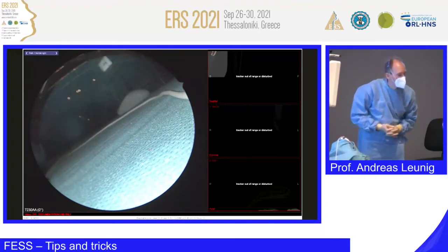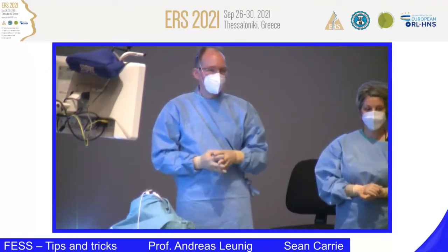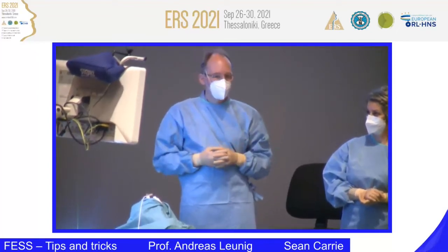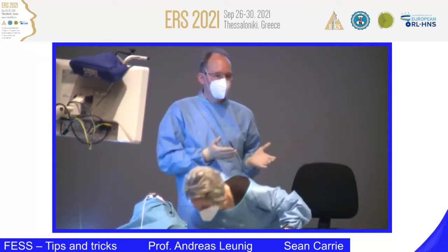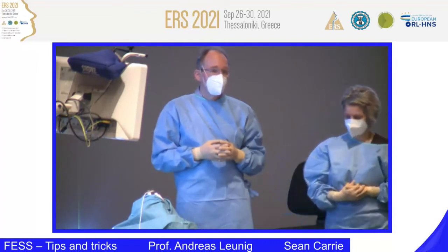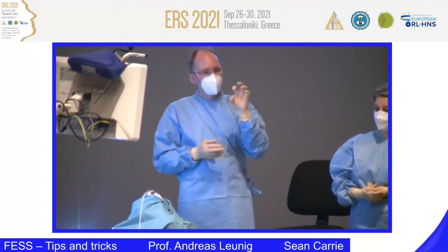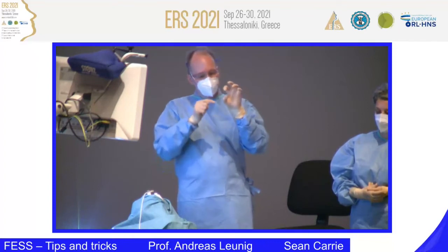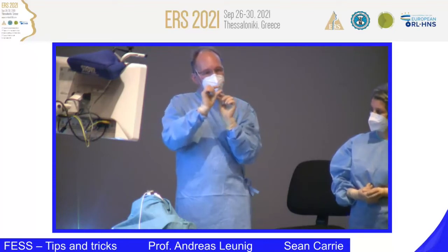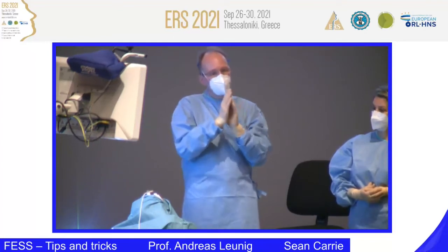Sorry, once again? Would you like a comment on agger nasi cells and how they block the frontal sinus opening? Yes, that's good. The agger nasi cell is quite a common cell, present in 90 or even more percent. If the patient has problems and you have a blocked frontal sinus, this can be the source, and then you have to make your proper dissection. The agger nasi cell is the most anterior ethmoidal cell. When you resect it, you take the uncinate process, and between the agger nasi cell and the uncinate process there's a conjunction. The uncinate process goes medially and posteriorly into the agger nasi cell.